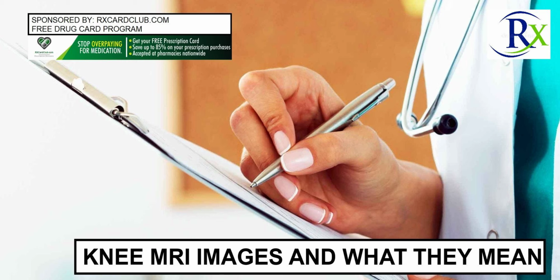MRI images and what they mean. Magnetic resonance imaging, MRI, can help your healthcare provider find the source of your knee problem. Compared to a normal knee, an MRI of an abnormal knee will show telltale problems such as fluid buildup or damage to the ligaments or cartilage. MRIs alone can't diagnose a knee problem, but they can provide strong evidence to support a diagnosis.